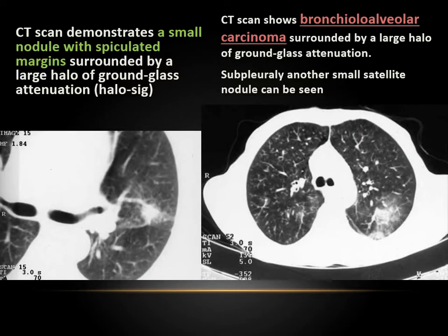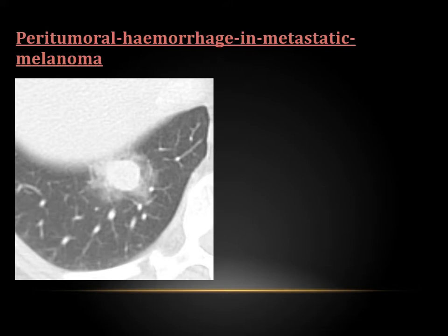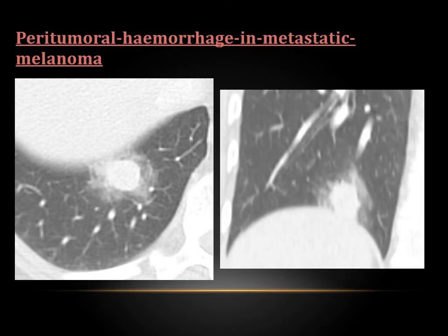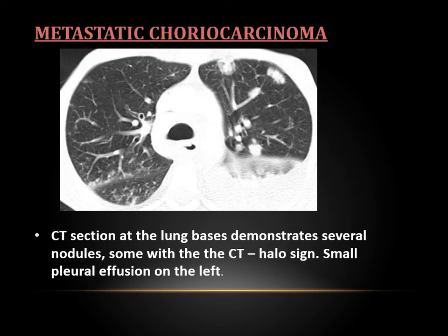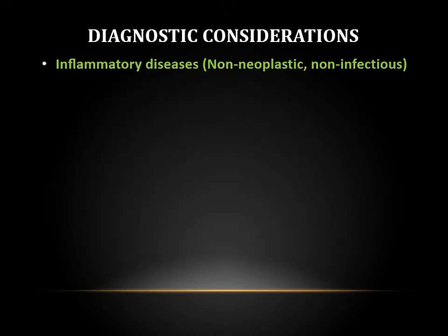This is a case of bronchoalveolar carcinoma showing two nodules — one on the right side is a satellite lesion surrounded by halo sign, and the other side is also surrounded by halo sign. This is a case of non-primary melanoma presenting as a single nodule with halo sign. This is another hemorrhagic case. This is also a case of multiple choriocarcinoma, which can be seen especially anteriorly.